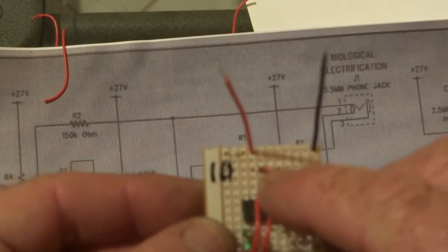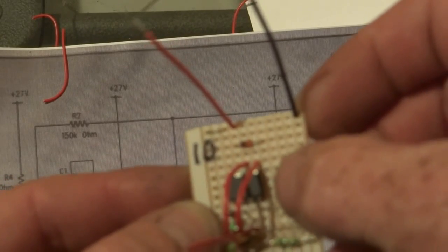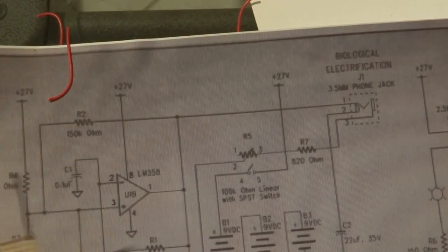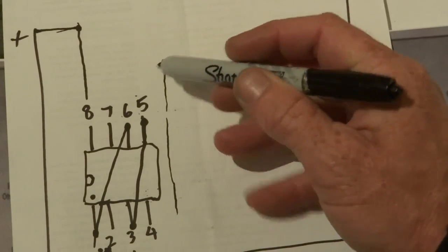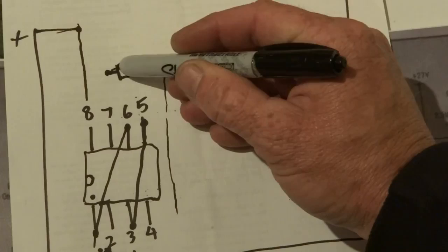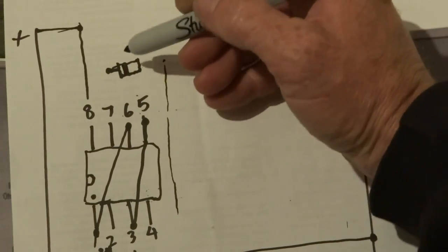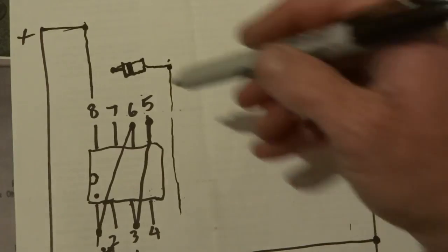You need to put a diode from number seven to the furthest track over from where the chip is — so basically the next track over. You'll need to put a diode from number seven, with the line on that end, so it should go like that.